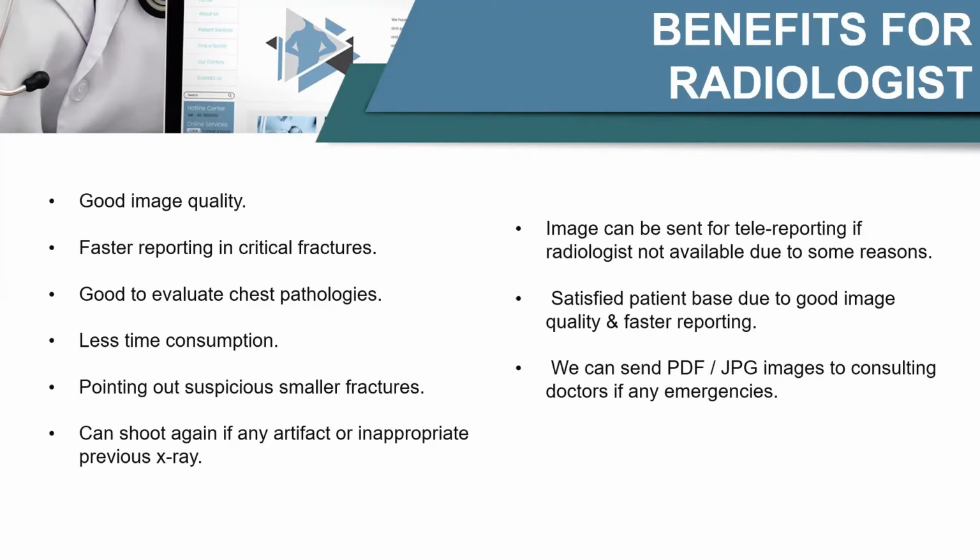So we hardly take 15 minutes to develop an image, and for reporting it takes hardly 5 to 10 minutes. So within half an hour, the patient goes off with his reports and images. We can point out some suspicious fractures which are hard to understand by a consultant or a physician.